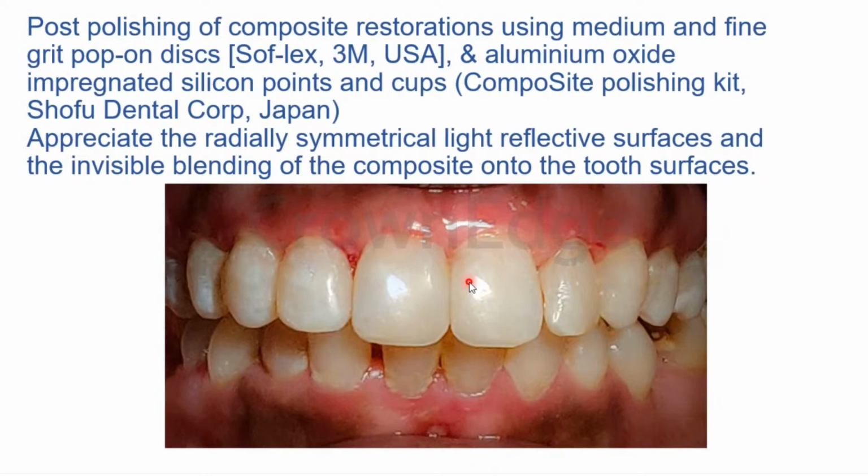So yes, which is the best generation? If you ask, I would say fourth generation. But if you ask which brand or which particular product to use, it would be OptiBond FL by Kerr and Clearfil SE Bond by Kuraray, which are fourth and sixth generation respectively. You can even use the fifth generation OptiBond Solo Plus by Kerr. That is also excellent, but you need a separate etching for that, right?